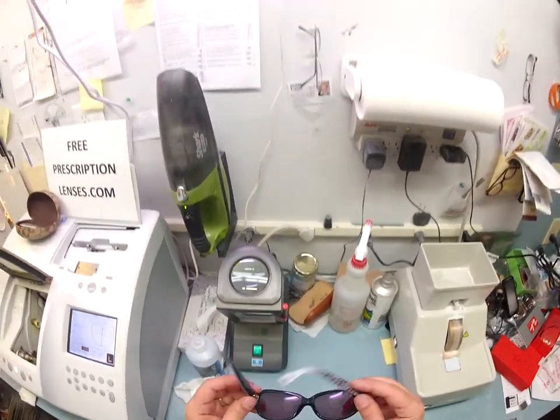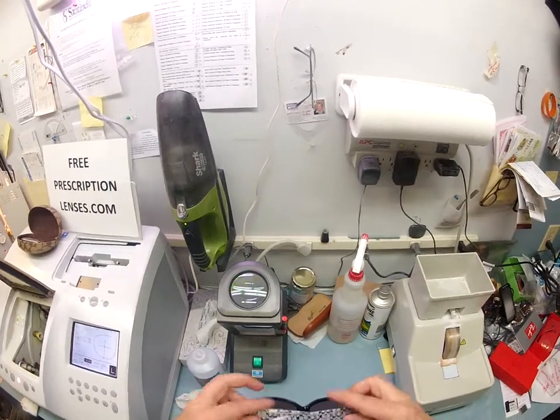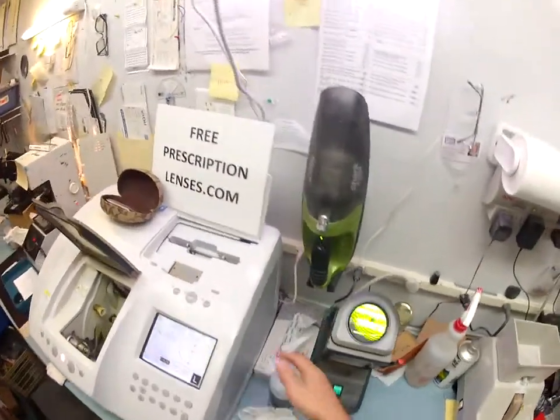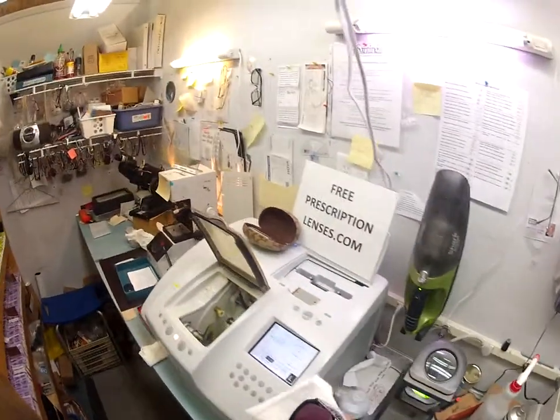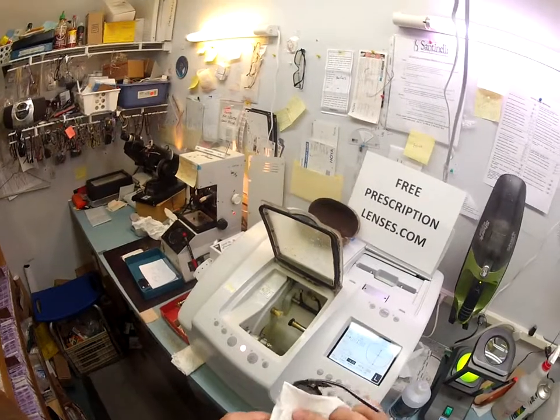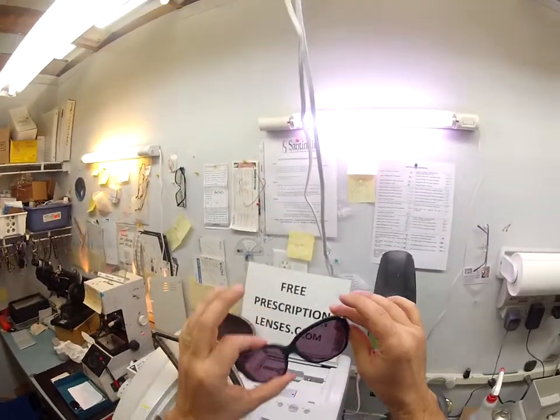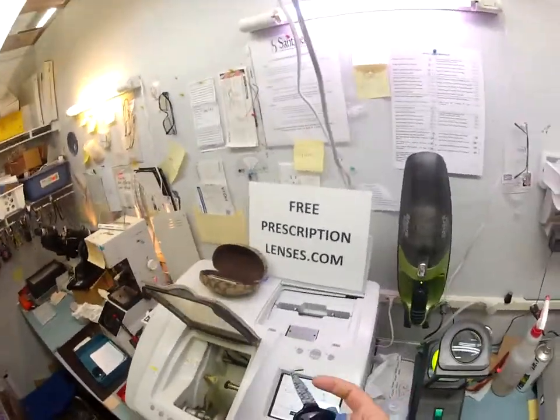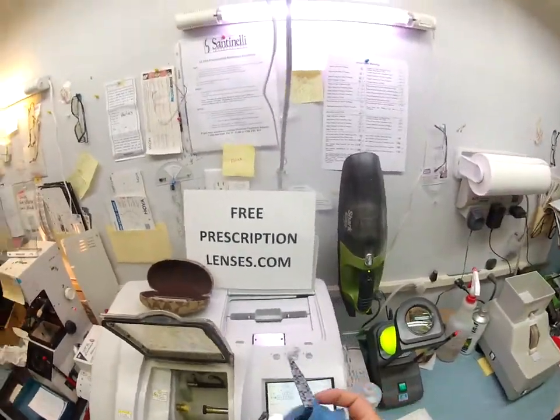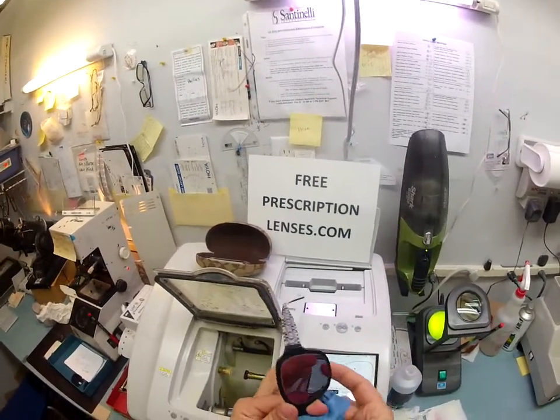I do that. I'm going to close each temple to make sure they overlap perfectly and the same amount of tension on both sides. Now I'm going to use my optical grade acetone to clean the red dots off. Now 99% of all optical shops do free adjustments. So if you find that these are too loose, too tight, too crooked, or one side is higher than the other, because 80% of people have one ear that's higher than the other. That's why every pair of glasses has to be adjusted. And then of that 80%, 50% have one ear that's closer to than the other.